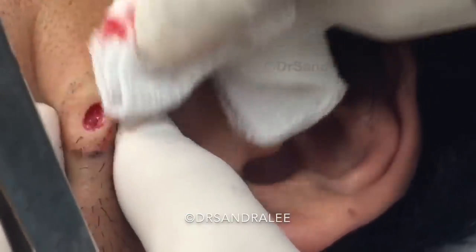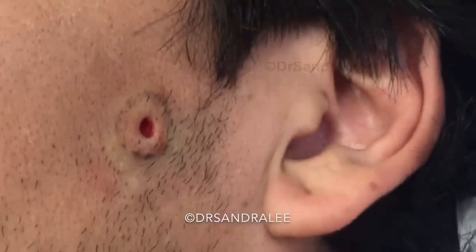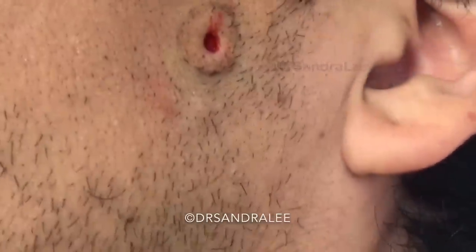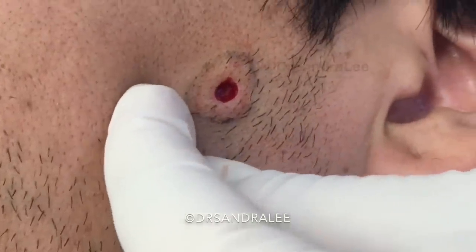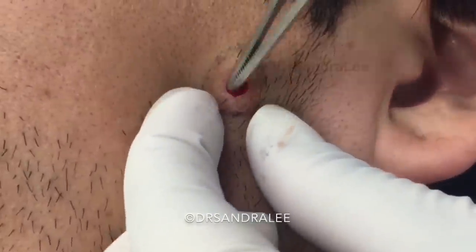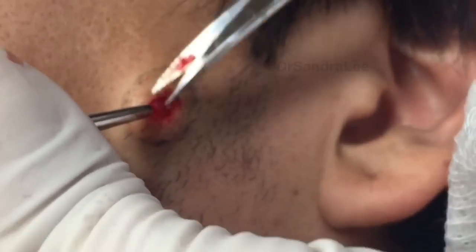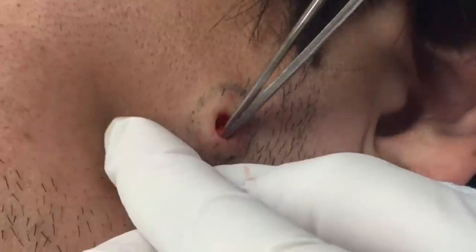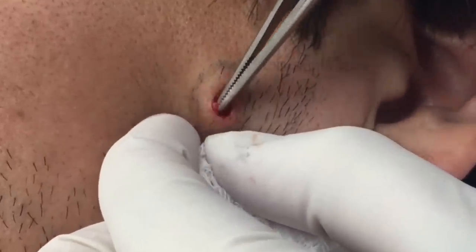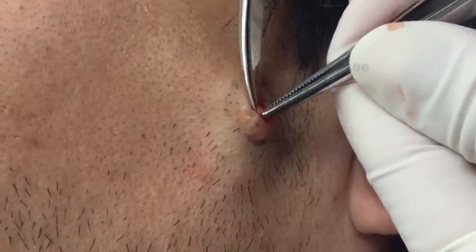I'm going to squeeze it just to make sure it looks nice and neat, but I'm going to trim around there a little bit and take an extra look. I'm going to just clean it off a little bit and check and see. I'm switching to my other pickups here — making sure no contents are still in there. The issue is with cyst walls: if there's a little bit left, it can be like a worm where you cut off their tail and they seem to grow back. I always make sure it's all gone. I think there's an edge right here — let me just make sure we got it all.